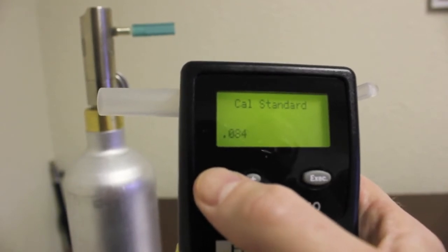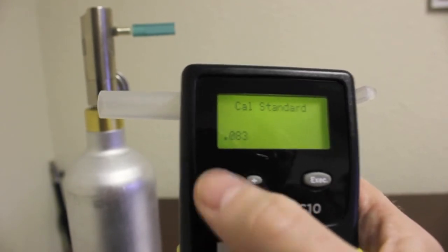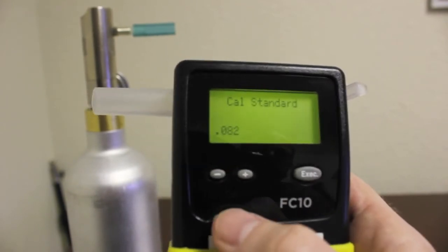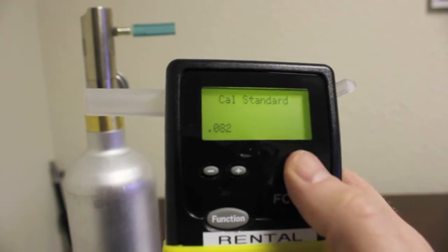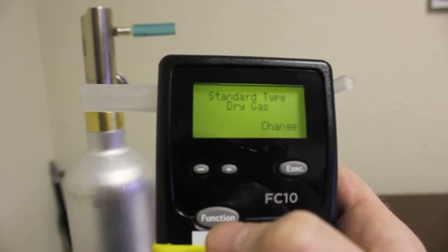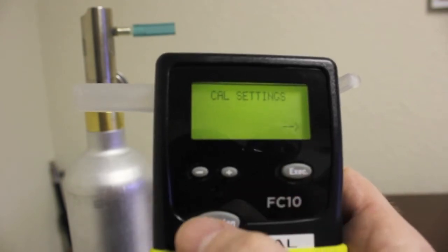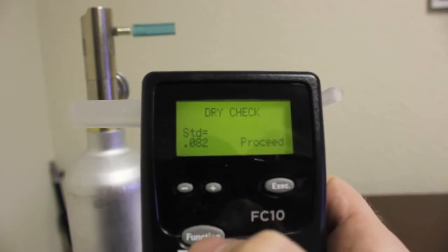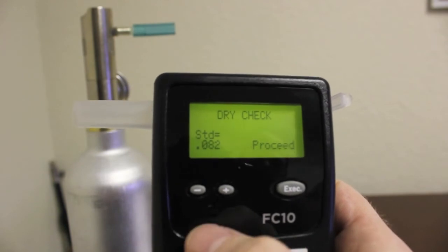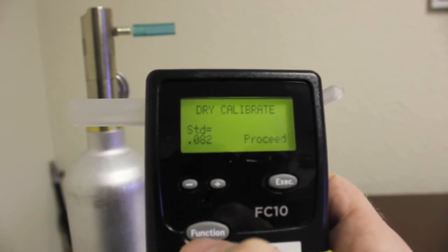Press the Function button until you reach the Exit screen and press the Execute button to exit back to the Cal Settings screen. Press the Function button until you reach the Dry Calibrate screen.